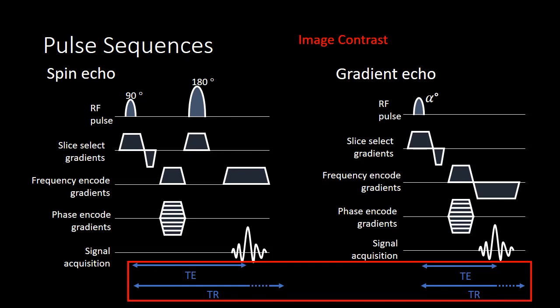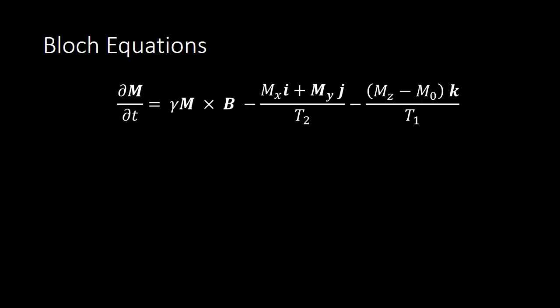And we use the timing of our pulse sequences to generate T1 and T2 contrast based on when we want to take our picture relative to the decay or recovery of our signal. And I've also used Bloch equations throughout the talk, and I think that these are a really helpful tool when we're trying to understand the net magnetization as it varies in time.